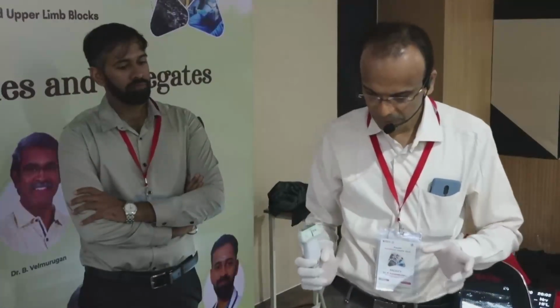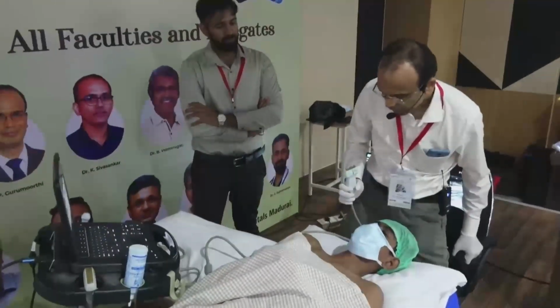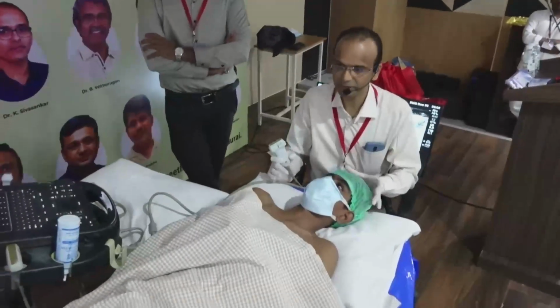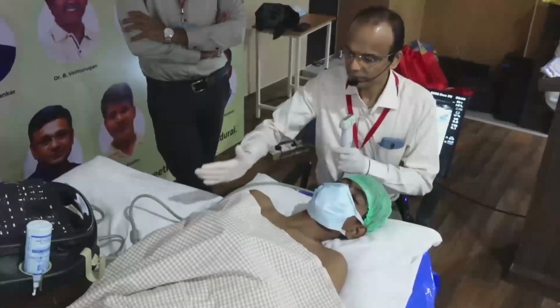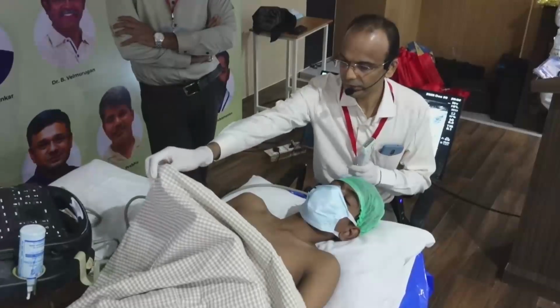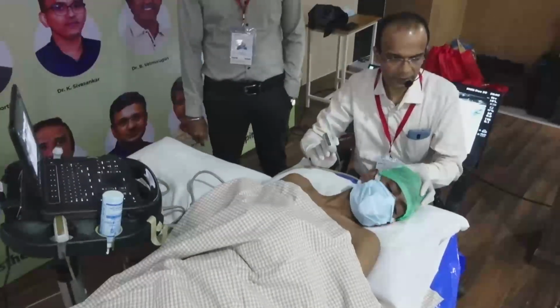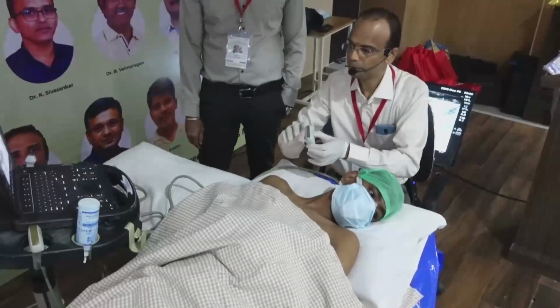Majority of the time we keep the supine position, we stand in front, at the head end of the patient, and preferably ergonomics should be very good. I would like to always sit and give the block, preferably adjusting the table according to comfort. The patient is supine, and first we'll start with above the clavicle area scanning. The patient's limb is adducted and resting over the chest, and I'm telling him to turn the head towards the other side. Then we have to orient the probe also.